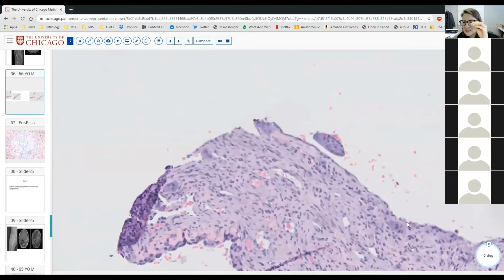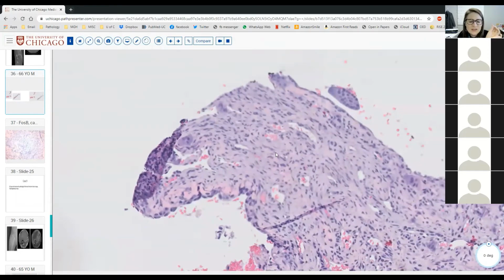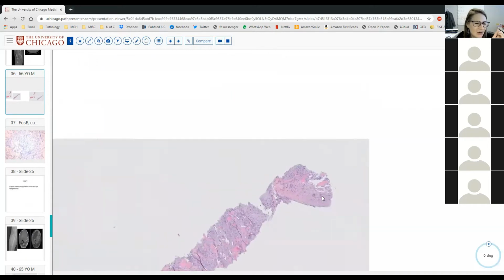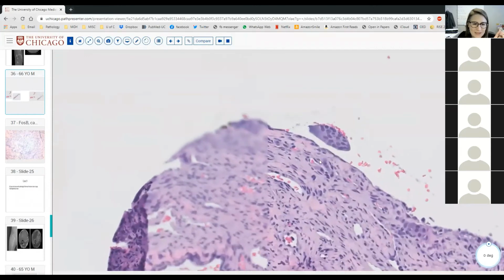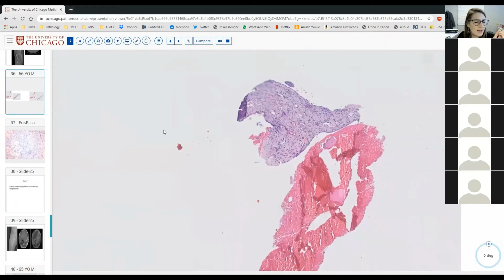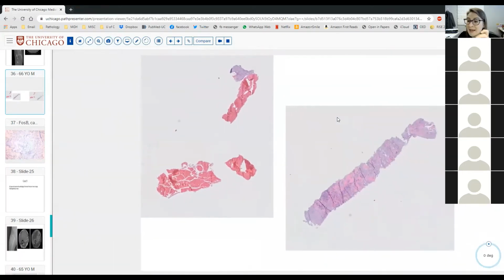Yeah, we see a little tissue lined by these cells with a little giant cell jumping off, right? And then this lining here again. And so don't forget, jumping ship cells, lemmings. So don't forget that here it's a little more in focus, right? Don't forget that aneurysmal bone cysts can be solid, okay, and can make bone. So the two things that were top of our differential diagnosis were osteoblastoma and aneurysmal bone cysts.